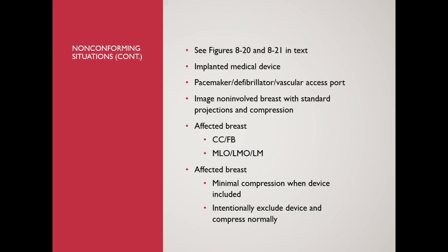On the affected breast, if you can't get the device out of the field, then you want to make sure you do minimal compression. Otherwise, you want to exclude the device and compress normally.